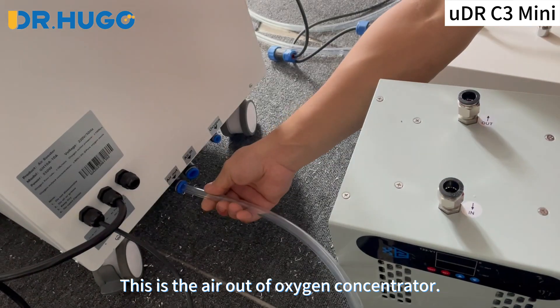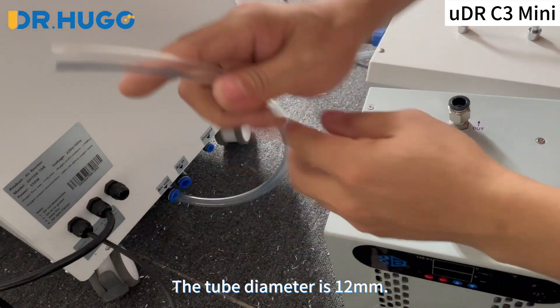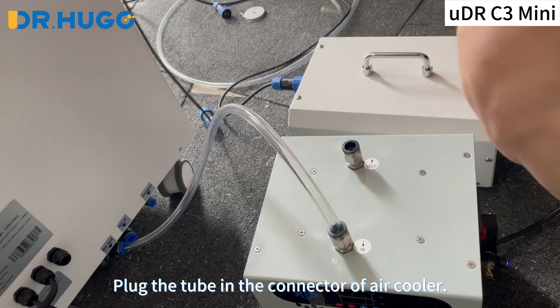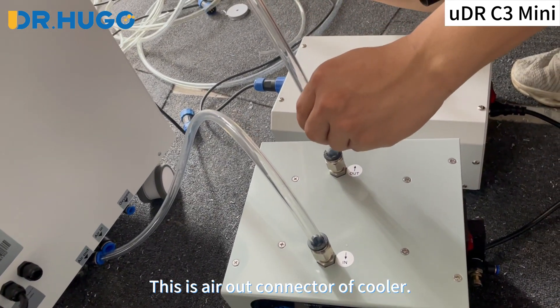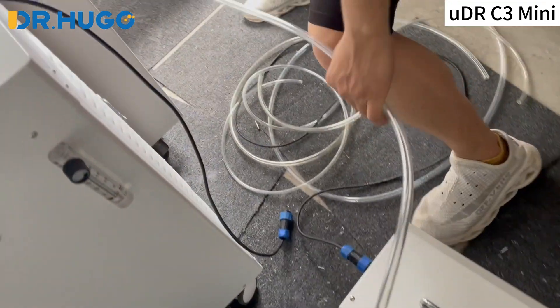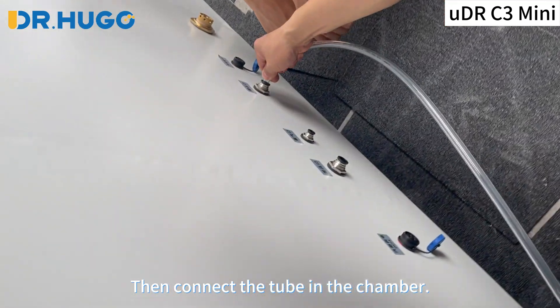This is the air out of the oxygen concentrator. The tube diameter is 12 mm, plus the tube being the connector of the air cooler. This is the air out connector of the cooler. Then connect the tube in the chamber.